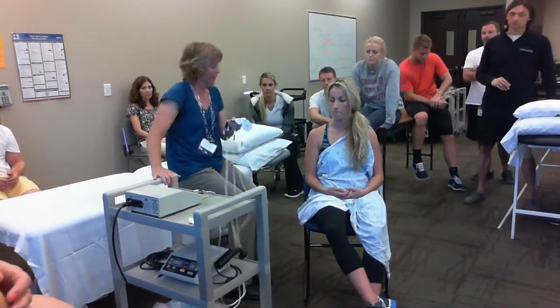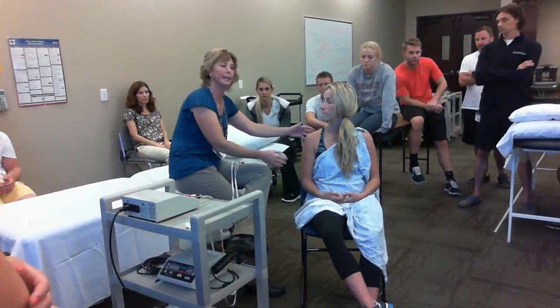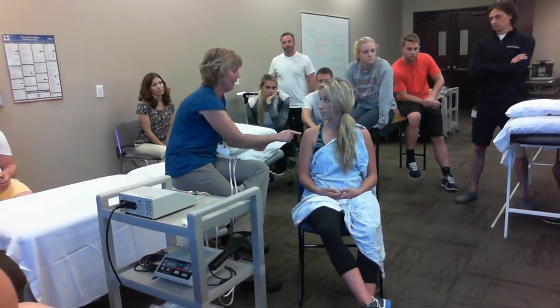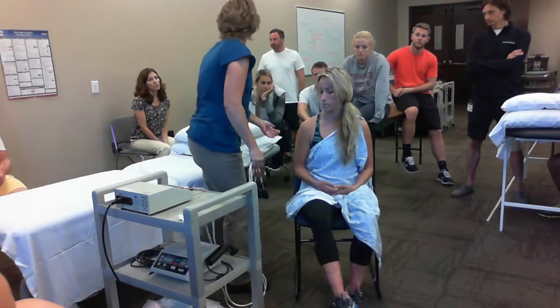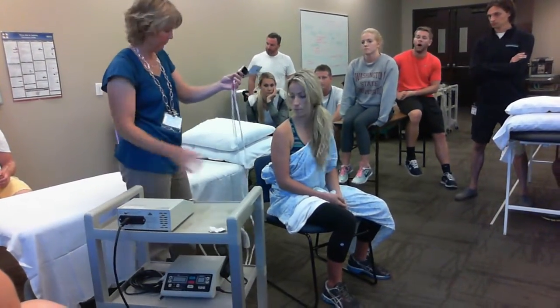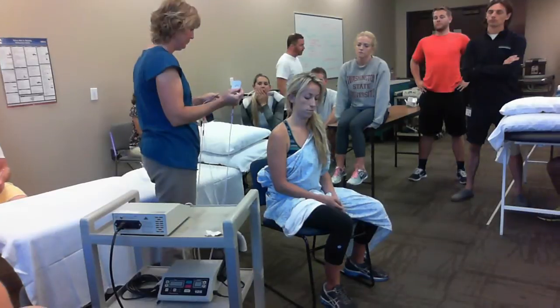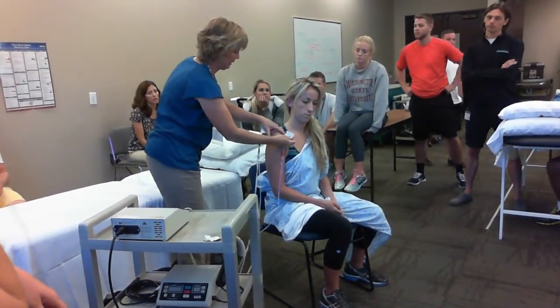For acute pain, I would like the electrodes to be in a broad area so that it can get to all of her very painful shoulder region. If I put them all too close together, I'm going to get just a tiny little spot in that shoulder. And your check sheet will talk about acute pain to surround the pain and more chronic pain to put the electrodes on the pain. So make sure you're getting it broad enough for that acute pain especially.